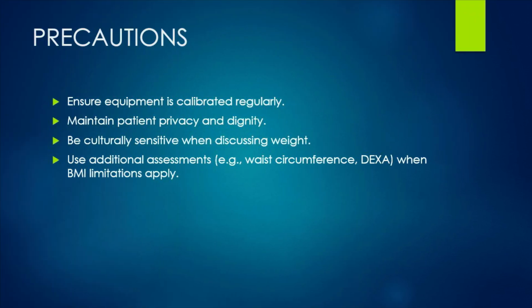For precautions, use care with patients who have balance issues or mobility limitations. Be sensitive when discussing body weight and avoid stigmatizing language. Ensure consistent technique and regularly calibrate equipment to improve accuracy.